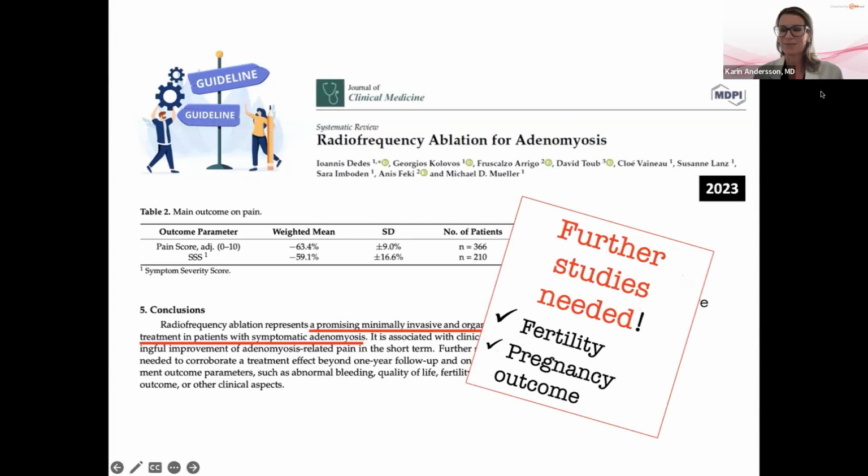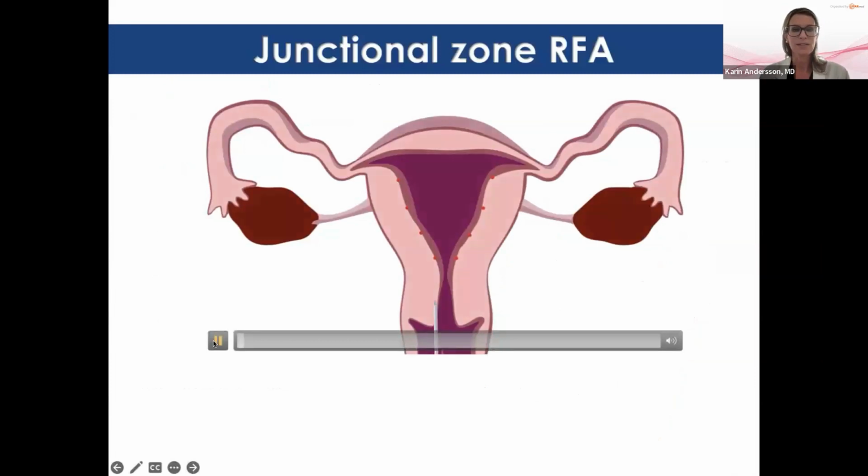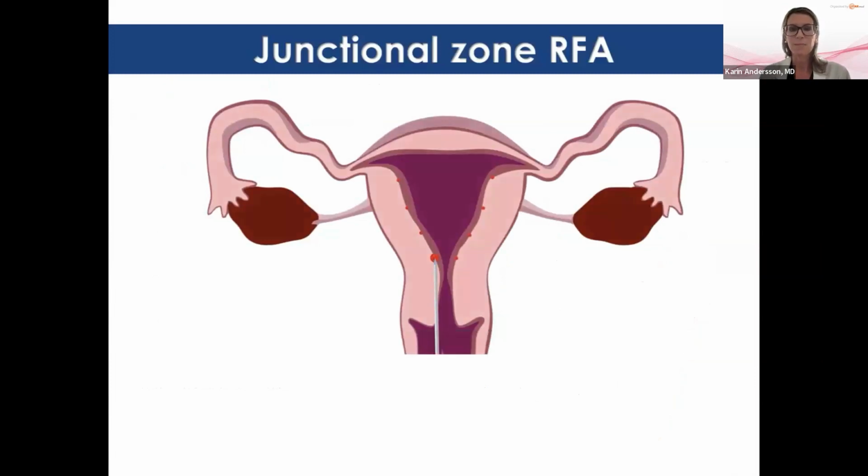Sorry about that. Some interference with the computer. So we need to study this better, because of course it could be very nice to offer this kind of solution to adenomyosis patients also. This is just to show you how it could be. We are thinking about treating the junctional zone with radiofrequency, really choosing where to treat and maybe where not to.